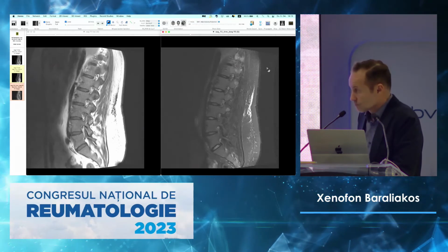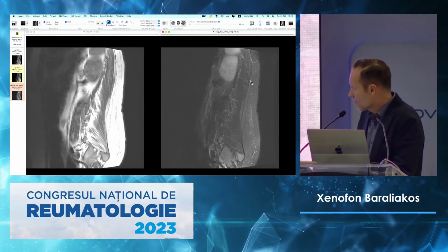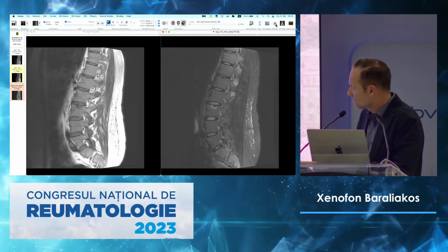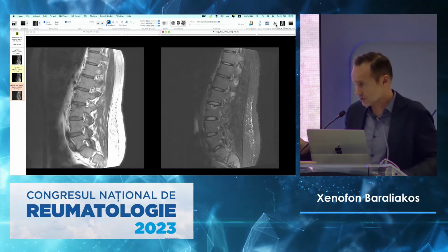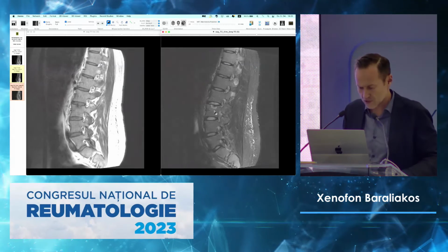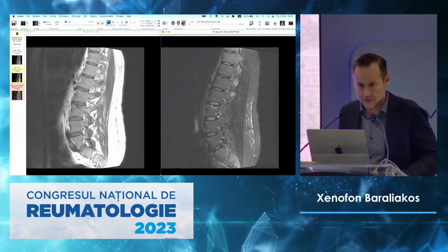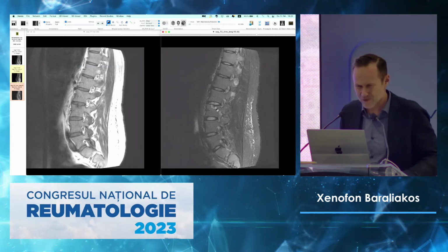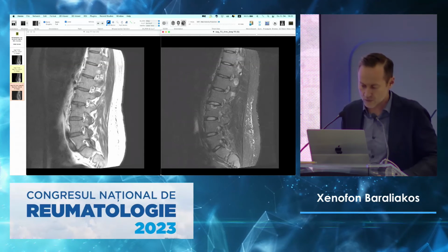There is a facet joint involvement, I think, in the upper part. We have many different things. And there is a scoliosis, I think, because you have a different point in the upper part too. So if we stop here, I will come to what you said in a second. Most of the people who I show these images pay attention to this here. That's nothing. We all have that, maybe. It is a typical insertion of the disc. It may hurt a little bit in the beginning, but as you said, the most important finding of this patient is this one.